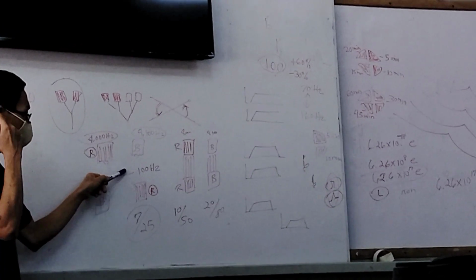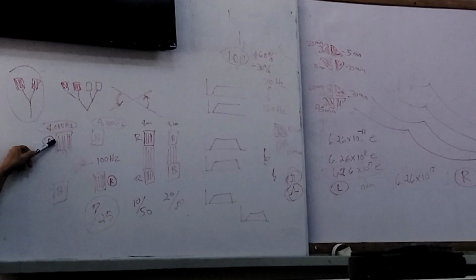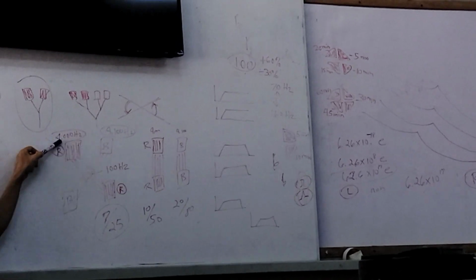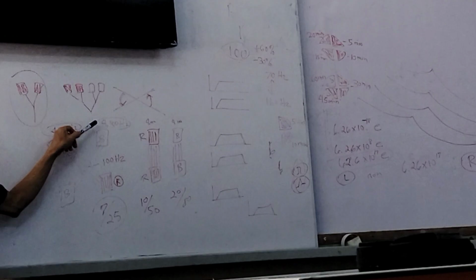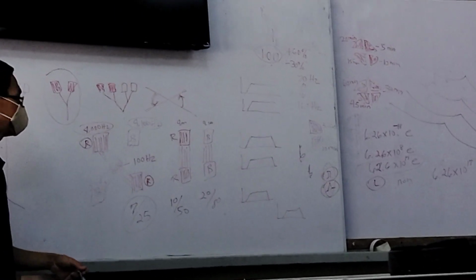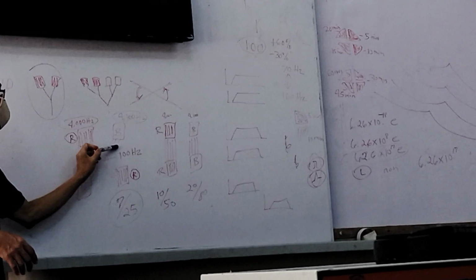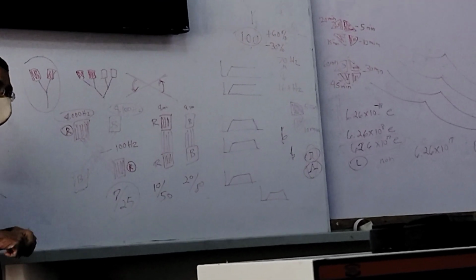The interference happens outside the machine. For example, the red produces a current of 4000 Hz, a medium frequency current, and the black produces a current of 4100 Hz, also medium frequency. Once they interact or interfere, the resultant frequency is 100 Hz. That is where the 100 Hz happens.